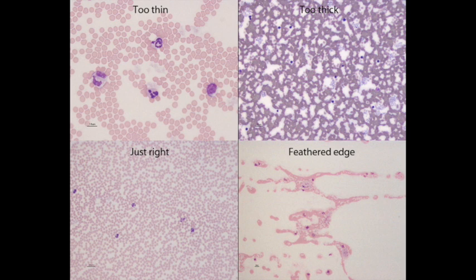In the lower left corner the field of view is just right. Notice that the red blood cells are what we call a mono layer which means none of them are overlapping. It's one cell thick and it's pretty uniform in distribution.